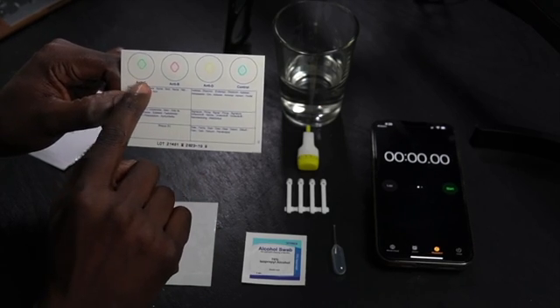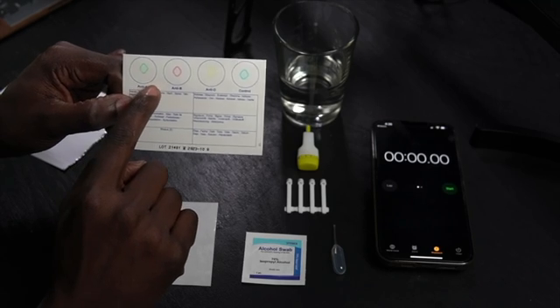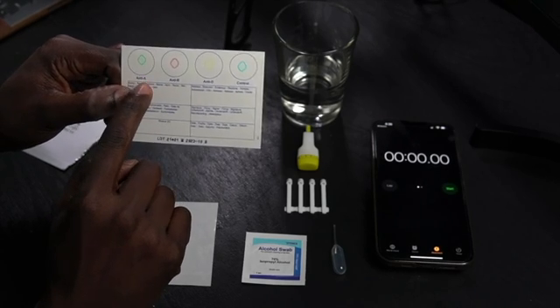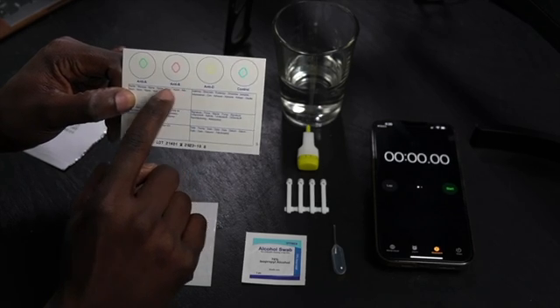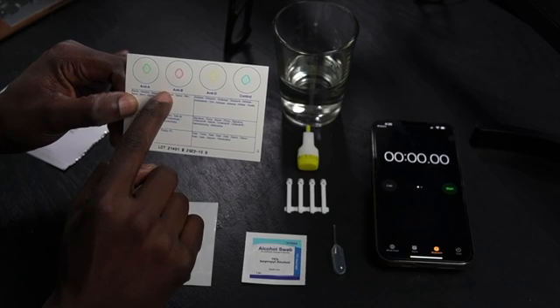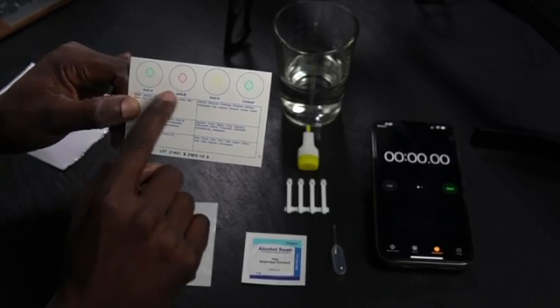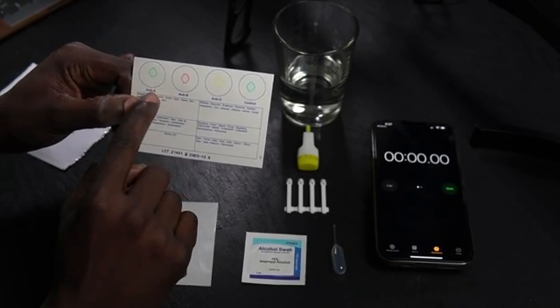So if you have agglutination in the anti-A circle, that person has type A blood. If you see agglutination in the anti-B circle, you know it's type B. If you see it in both of these, you know it's type AB. And if you don't see it in either of these, you know that it's type O. Once again, for a more in-depth explanation, check out my last video.